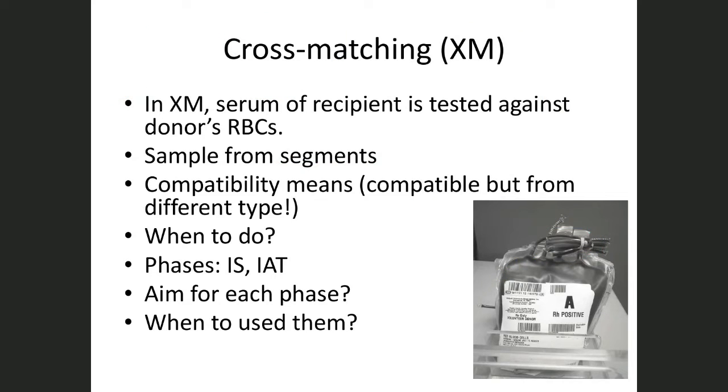So when we need to do cross matching, usually we need to do cross matching before transfusion. Maybe they call us 24 hours before, for example, or even earlier, and ask us to prepare, for example, 3 units for this particular patient because surgery will happen on that day.